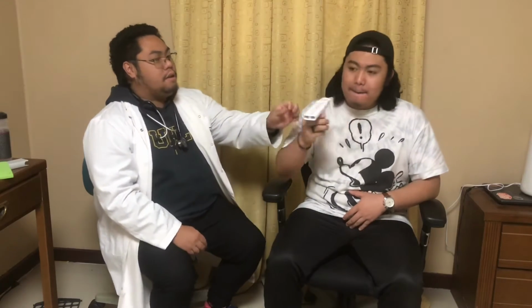Exhale! Okay, that's great. Great result. So after performing it 3 times, you're going to list down the best out of the 3 results of the patient's PEFR. And then we're going to perform this PEFR after the MDI administration to identify the difference between both. Now, let's go to the MDI administration.